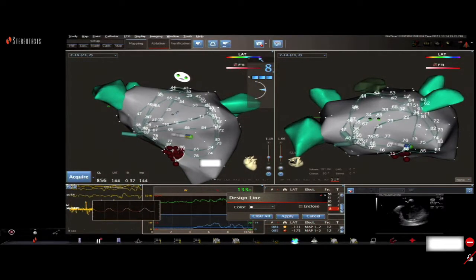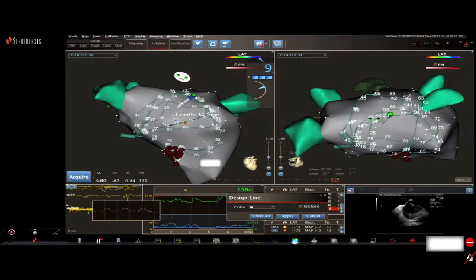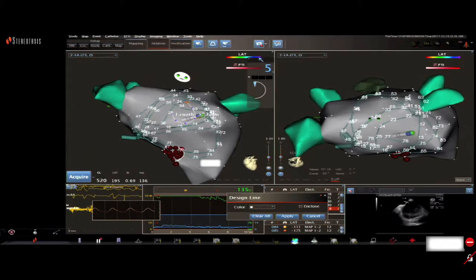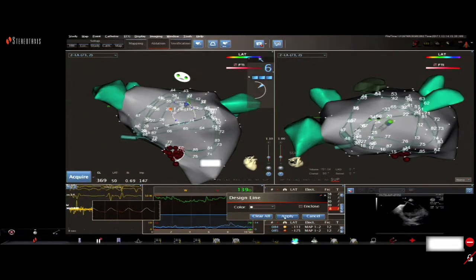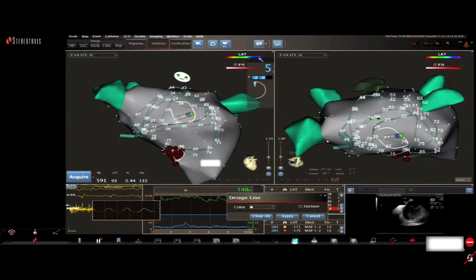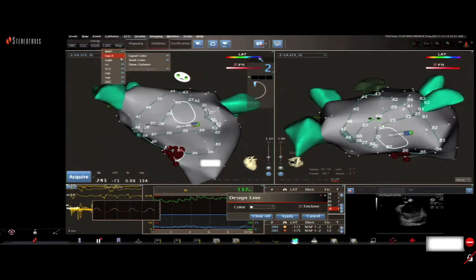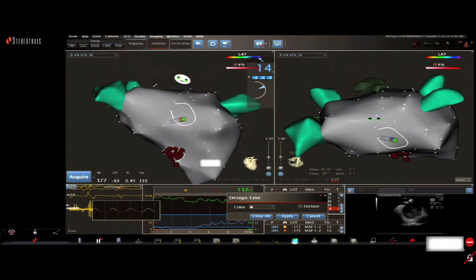And 24, 25 is in the roof. All right. So we can go ahead. Pete Smith? Any questions or identification of this area?